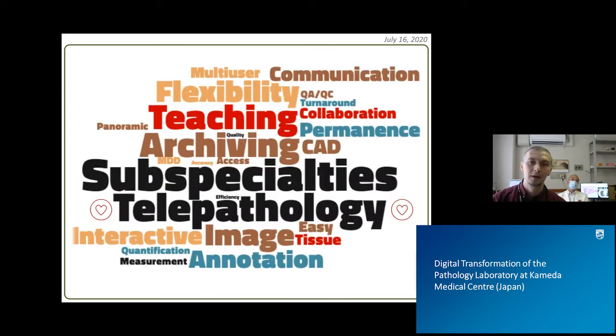Why digital pathology? This alone could be a topic of a whole lecture, for 30 minutes or 1 hour. I'll just make a short summary here, and this is my personal word cloud featuring the top values of digital pathology. Keyword number 1 for me is telepathology, which means accessing slides and making diagnosis remotely. I may call this concept anytime, anywhere. Number 2 is access to subspecialties, once again using the means of telepathology.